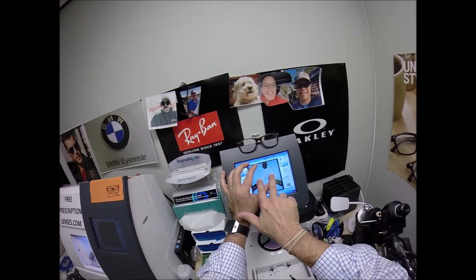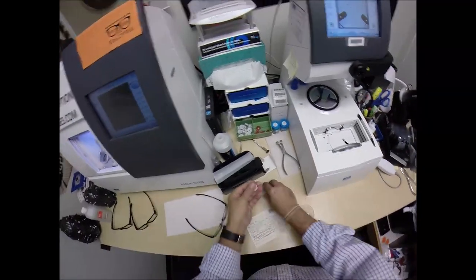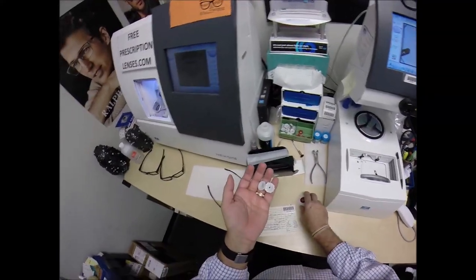And then every progressive has two laser engravings on the side. But first I need to grab a block, or as I like to call it, Jenny from the block. I need to attach this to your lens while it is cutting.